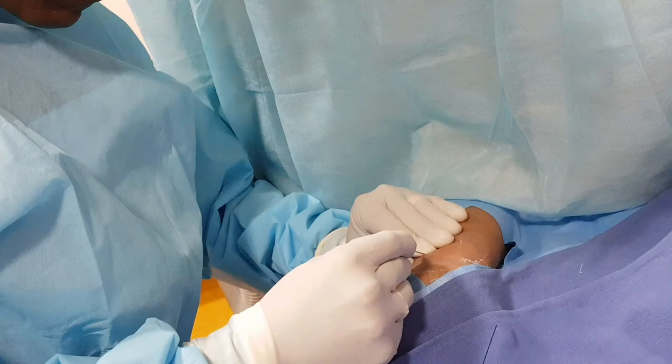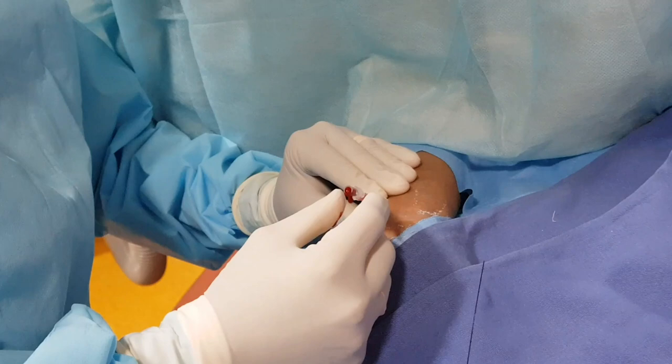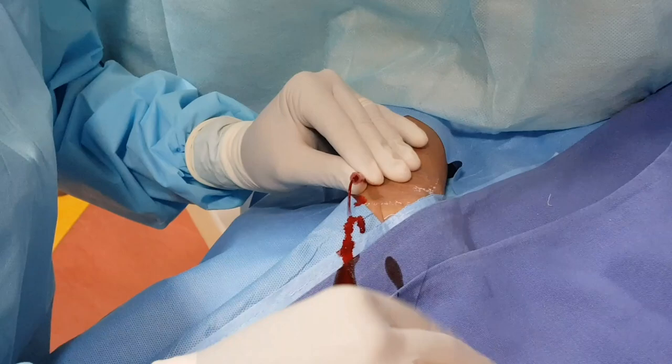We have to pass this needle into the radial artery — that is what I am doing now. Now the needle is inside the radial artery. I will remove the needle, and now you can see the blood gushing out of the radial artery. So now what I do is I pass this wire.